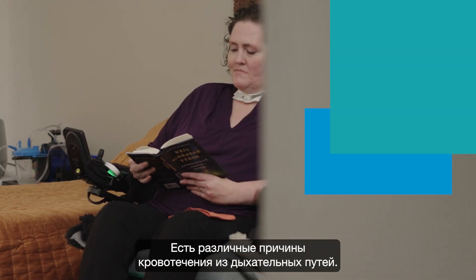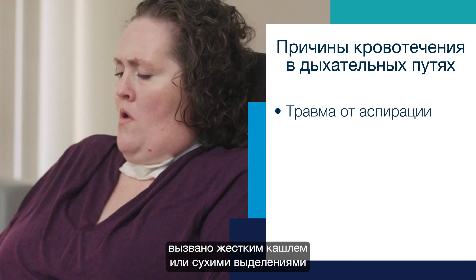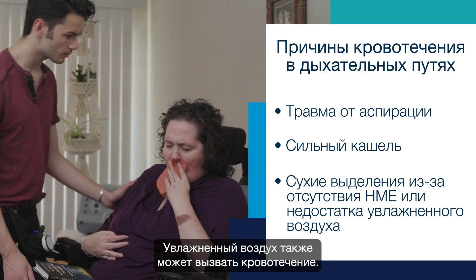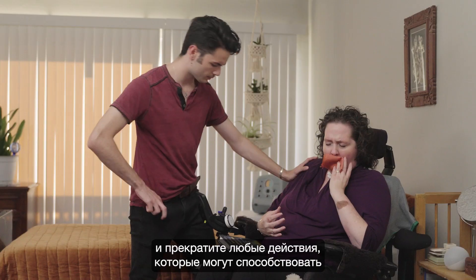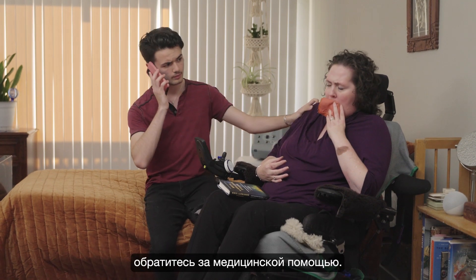There can be various causes of airway bleeding, most commonly trauma from suctioning. Vigorous coughing or dry secretions from not using a humidification device known as HME or humidified air can cause bleeding as well. Monitor the amount of blood that is being produced and reduce any actions that may be contributing to the bleeding. If it is more than a tablespoon of blood, contact medical help.